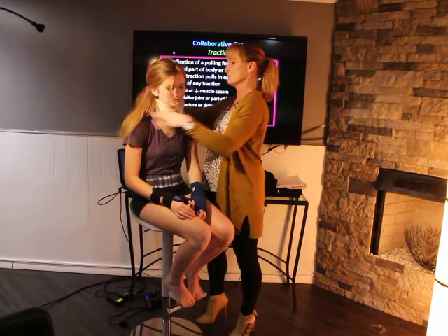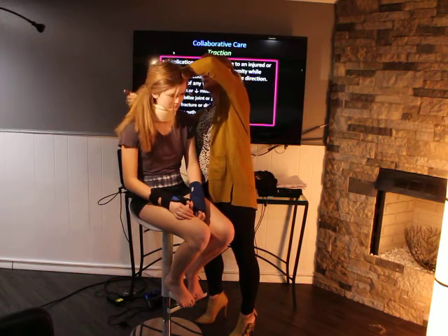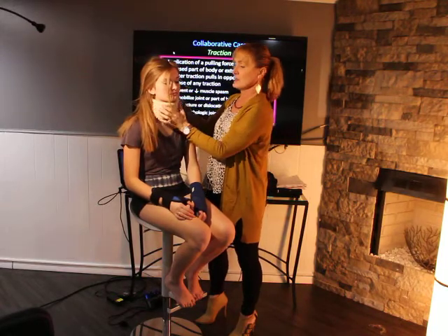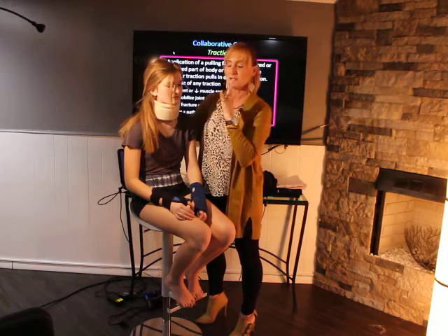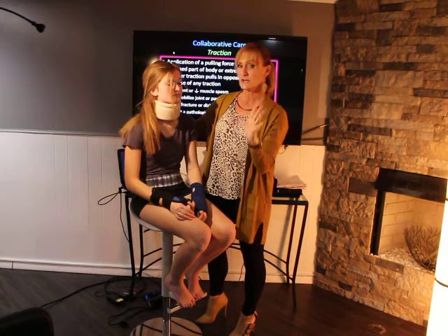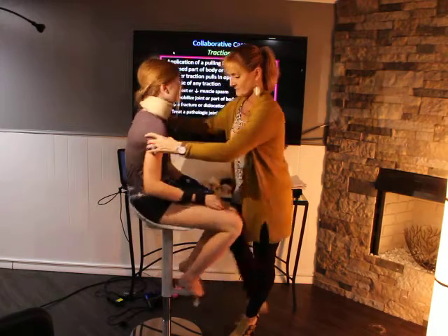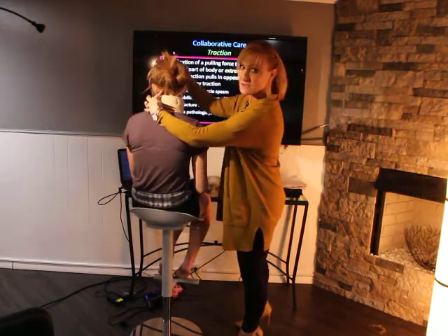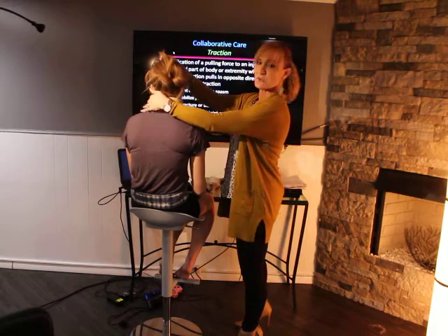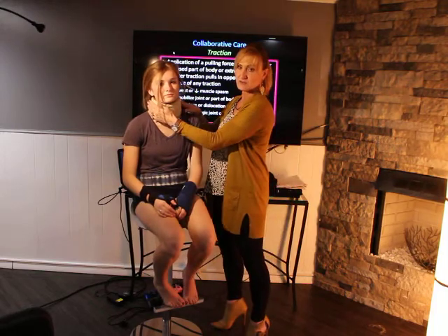So again, you're just going to put this around your patient. This would be important for a patient who has a neck injury following a trauma like in a car. They will come into the ER from the ambulance or the fire department with the hard plastic C-spine collars. You're going to need to make sure that this patient has good C-spine, and by C-spine, I mean these vertebrae right in here. You're going to need to get a good x-ray of that, make sure that they're not fractured, and then you might have your patient in something like this, a neck brace, just while the neck strain is healing.